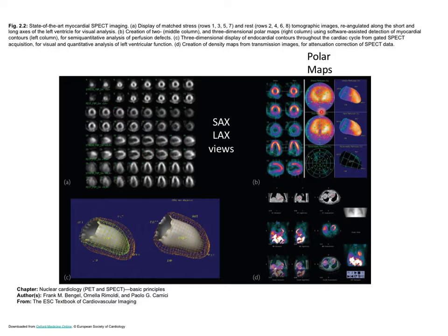The globe is the sphere, but this is just the bottom half. If you cut the Earth at the equator and map the northern hemisphere onto a flat piece of paper, we project it down like this, where the apex is at the middle. And then as we move toward the edges of this map, we're moving up towards the base of the heart.